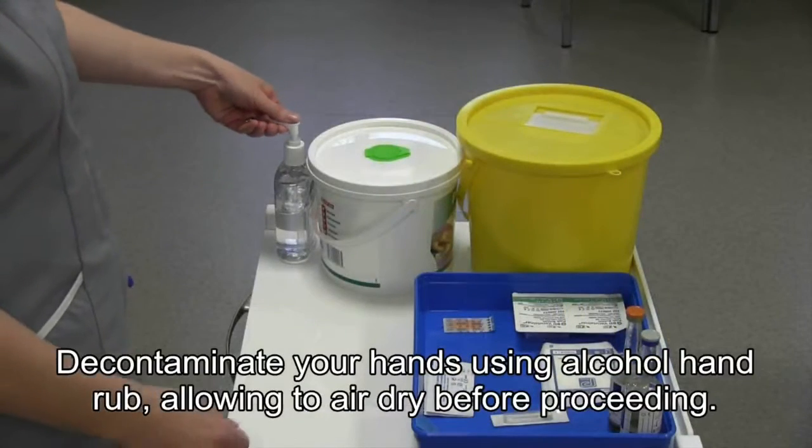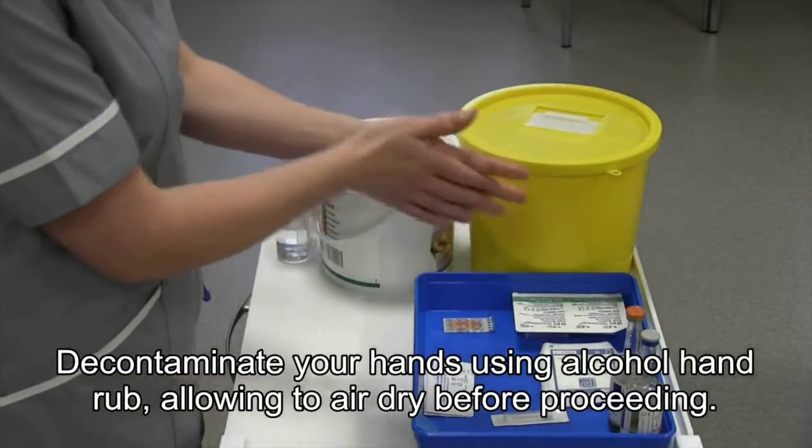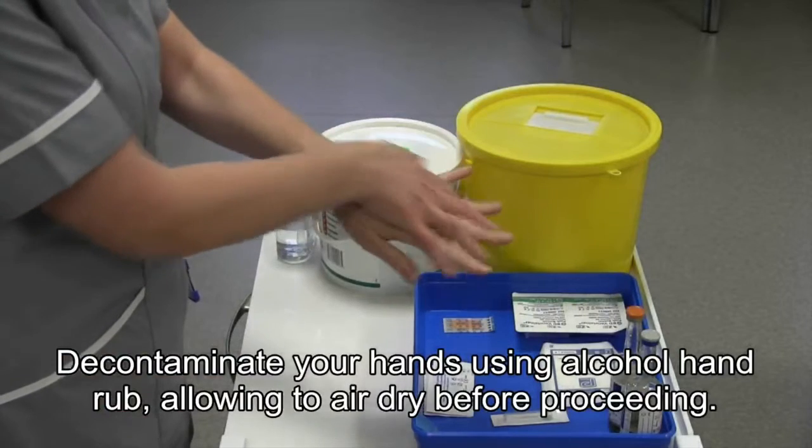Next, decontaminate your hands using alcohol hand rub, allowing to air dry before proceeding.